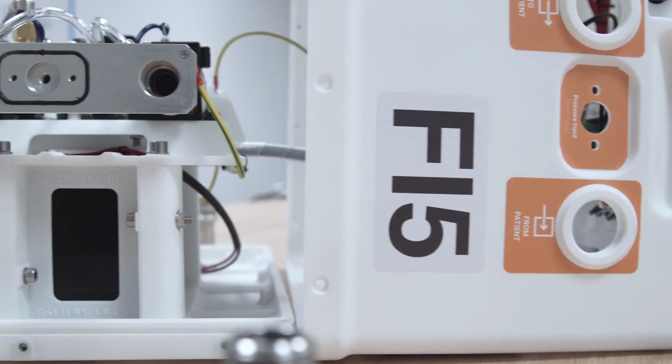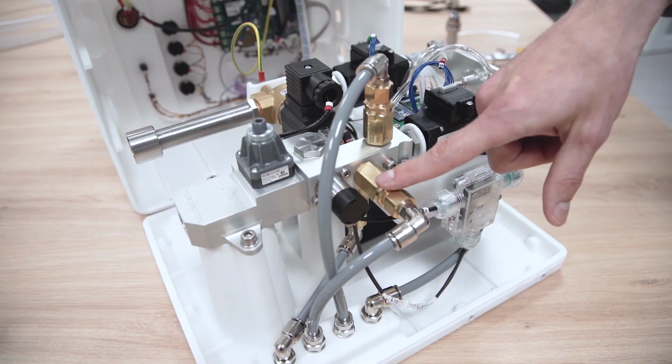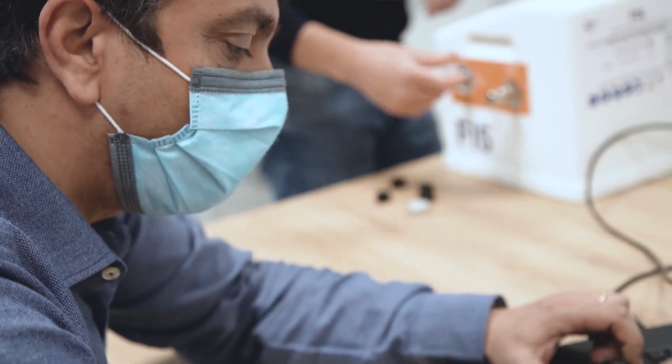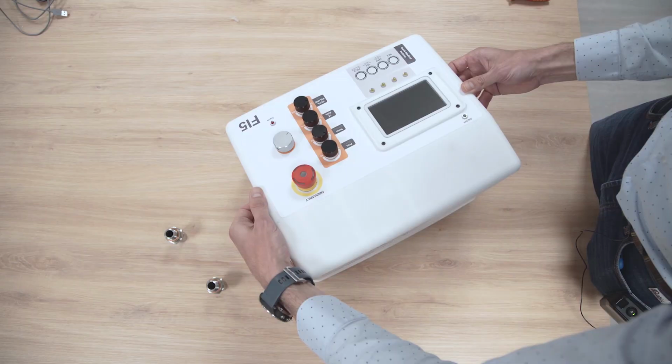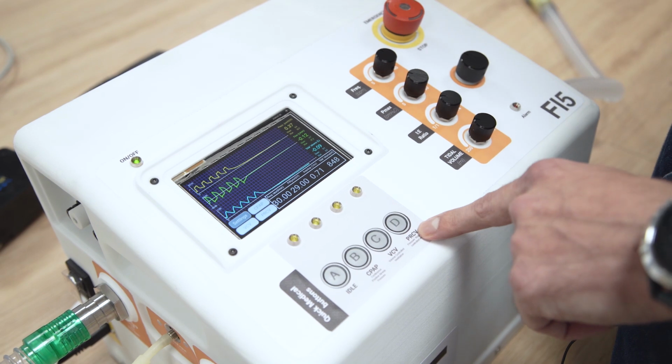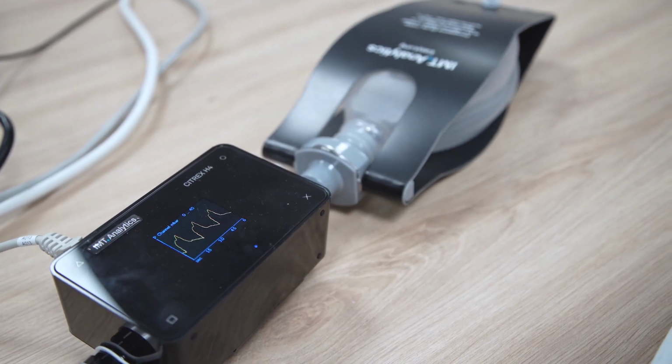And in order to work with these kinds of devices, we designed a particular control algorithm to control the amount of CO2 that is inside these masks. We released the entire project open source, starting from the simulation and the mechanics, the electronics, and also the wiring and the bill of materials of the project. And we also released the firmware and the software, so that anyone in the world can take this information and this project and realize their own product.